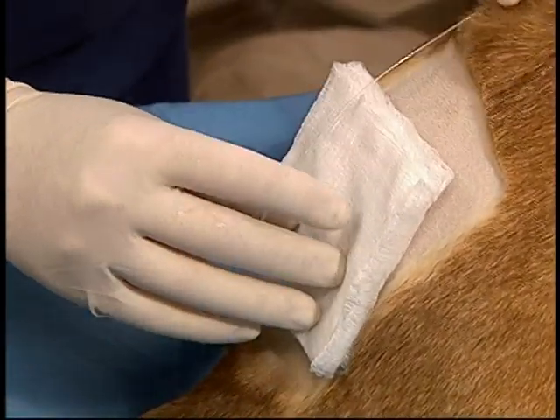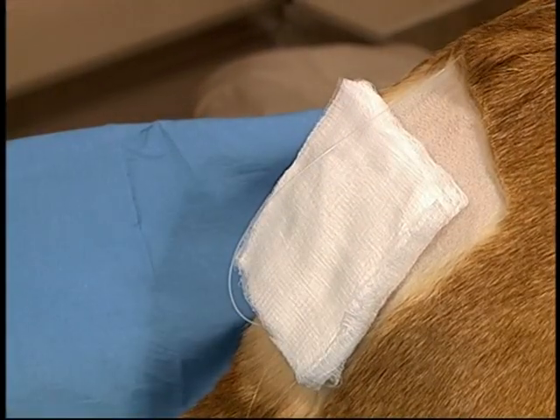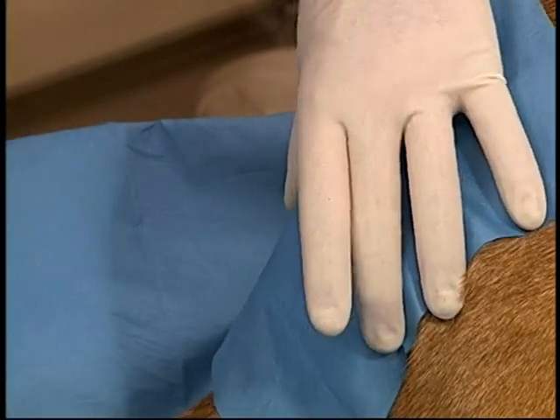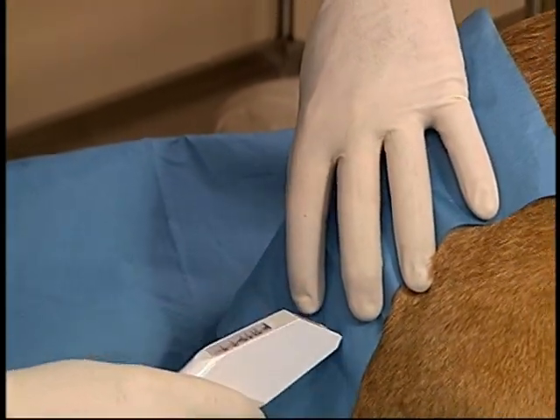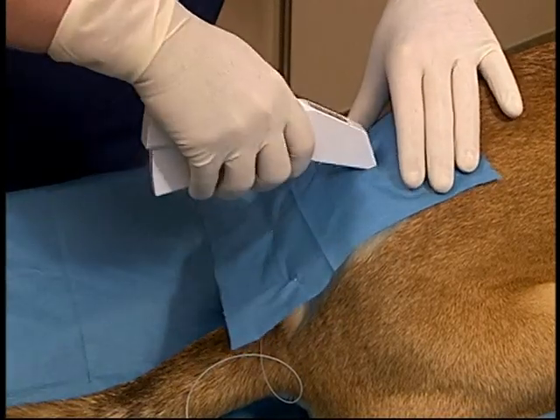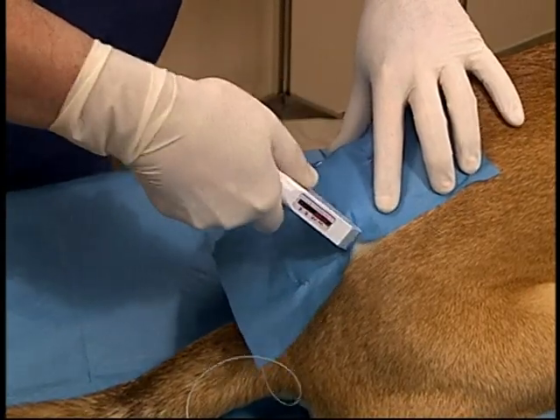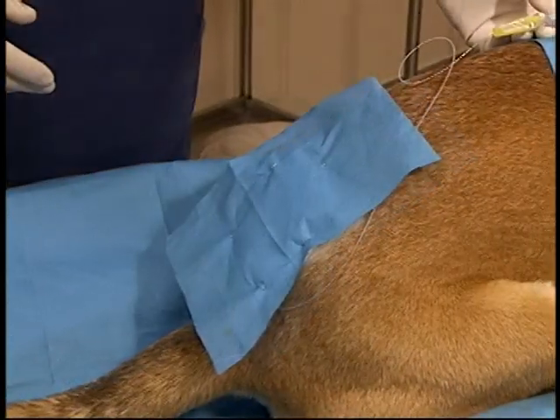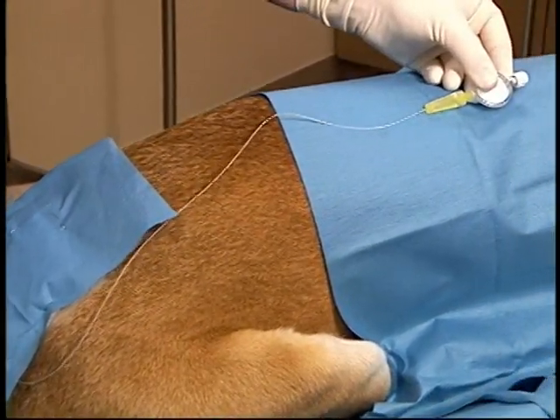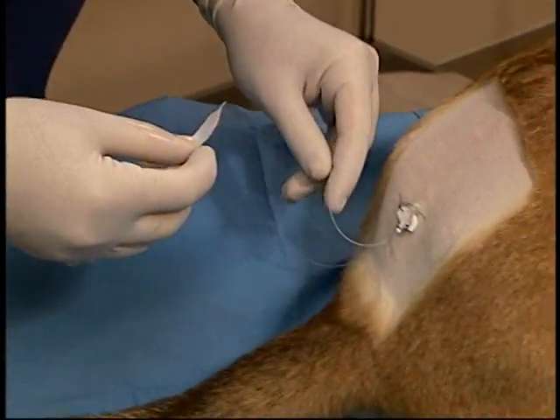Antibiotic ointment is placed over the skin entry site, followed by sterile 4x4s, and a water repellent dressing is placed on the outer edges. This can be stapled in place if this patient is to be going to surgery as a temporary dressing, and then once surgery is completed, this dressing will be changed since it frequently gets wet with irrigation. The catheter can be passed cranially so that the anesthetist is able to give additional drugs during the surgery.